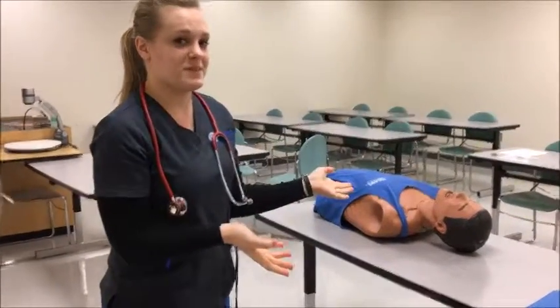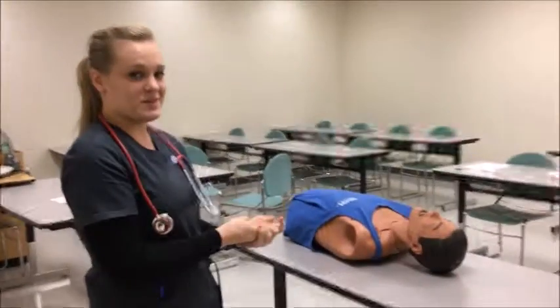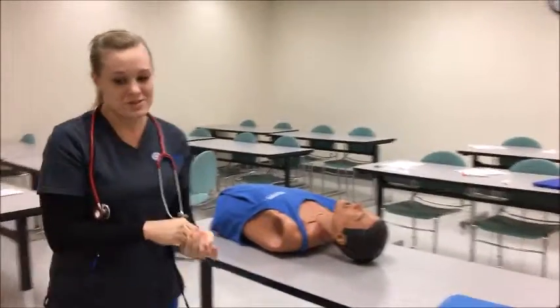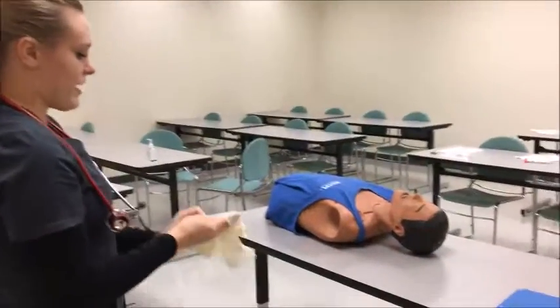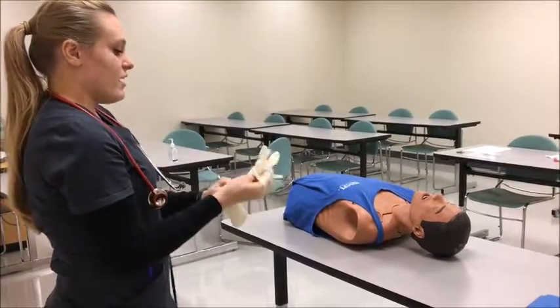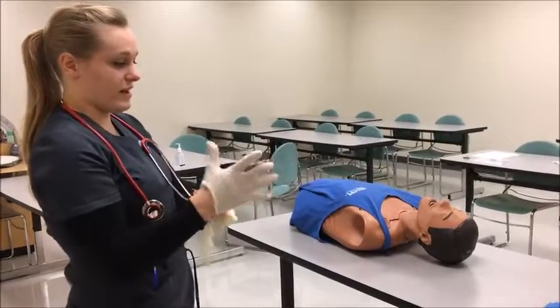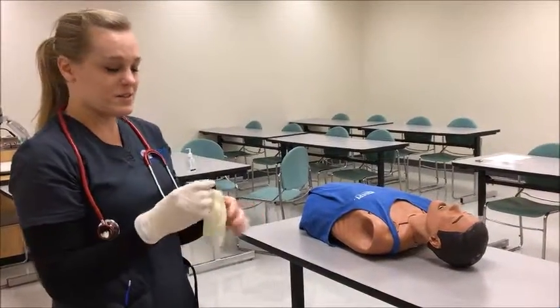For the purposes of this video, he identified his identity. He is Mr. John Smith, and I'm also checking his wristband to double check that it is Mr. Smith. Okay, Mr. Smith, I'm going to be applying your nasal cannula. The purpose of this procedure is to make your sats higher. Currently they're at about an 80, so we want them to be in the 90s or the 100s.